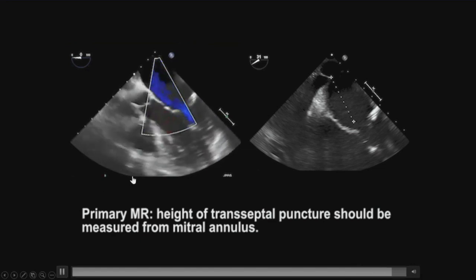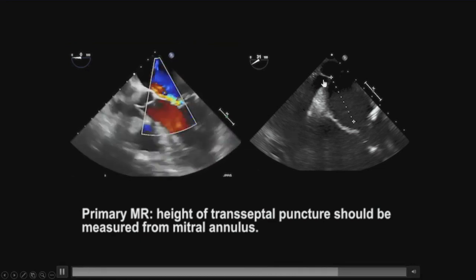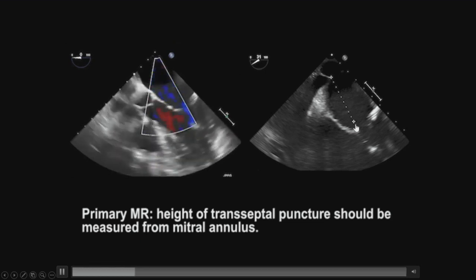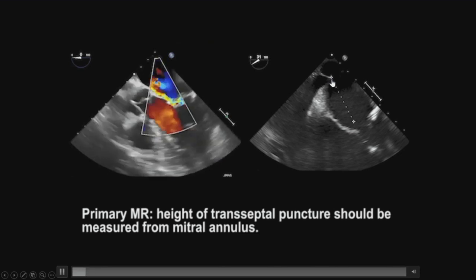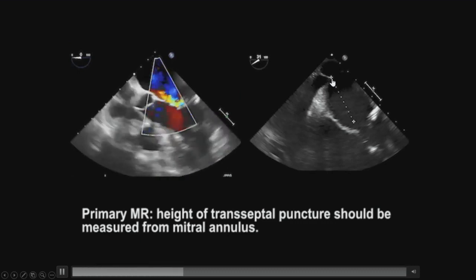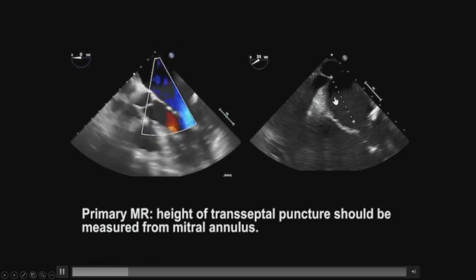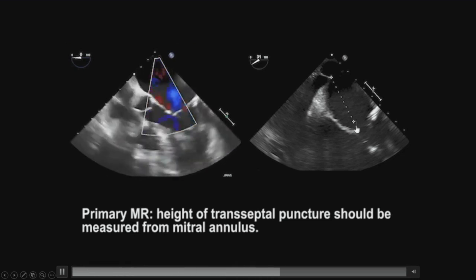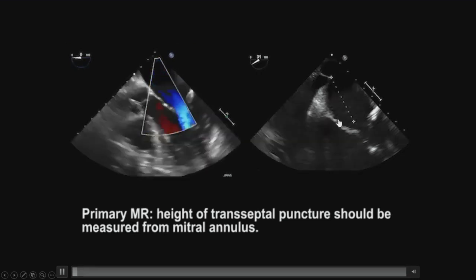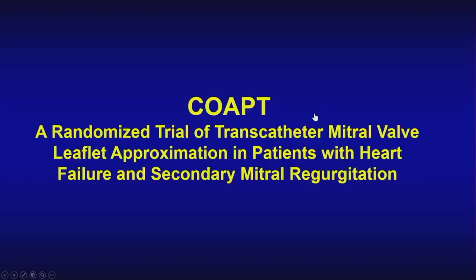So when you're actually doing a transeptal procedure, like I was showing you, what you need to know is that the height from where you're measuring where transeptal is key. This is how the echocardiographer will tell us. You've got to be posterior and high. Your height should be 4 centimeters or above, so that you will then be able to navigate your clip. If you're very low, the clip will have difficulty reaching the mitral annulus. You need to be posterior and higher. That is why, as I told you, the transeptal procedure is the key.